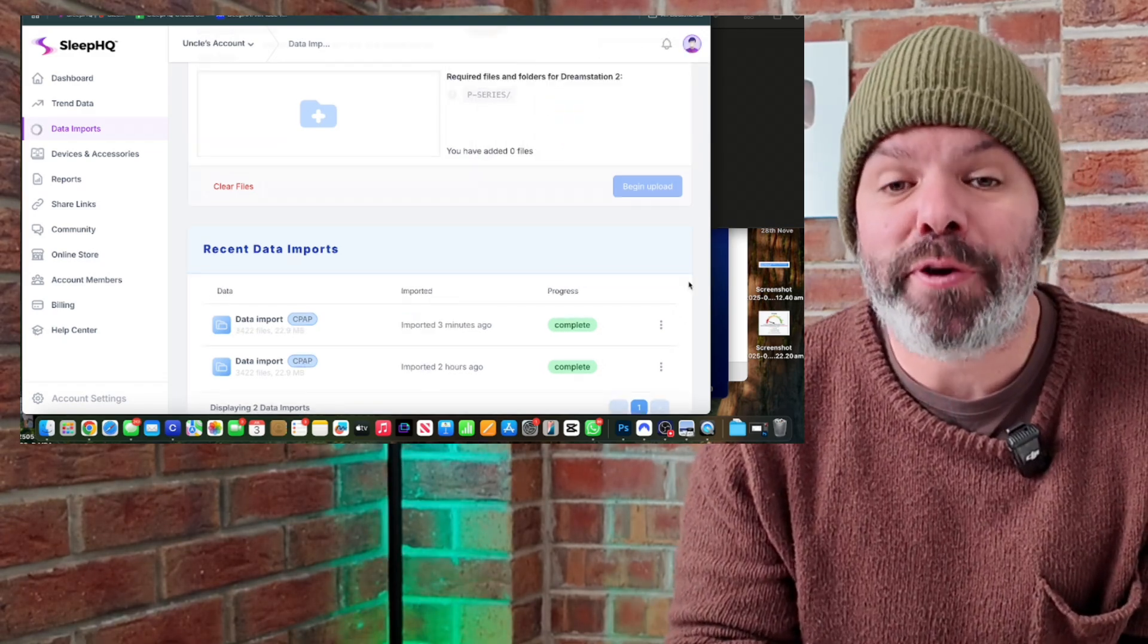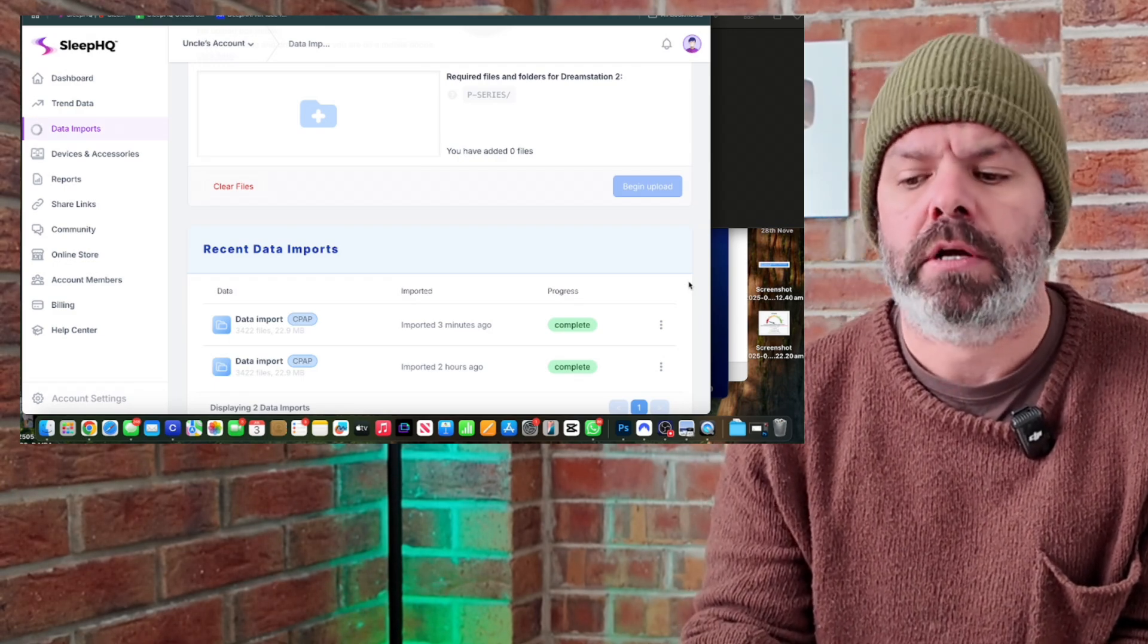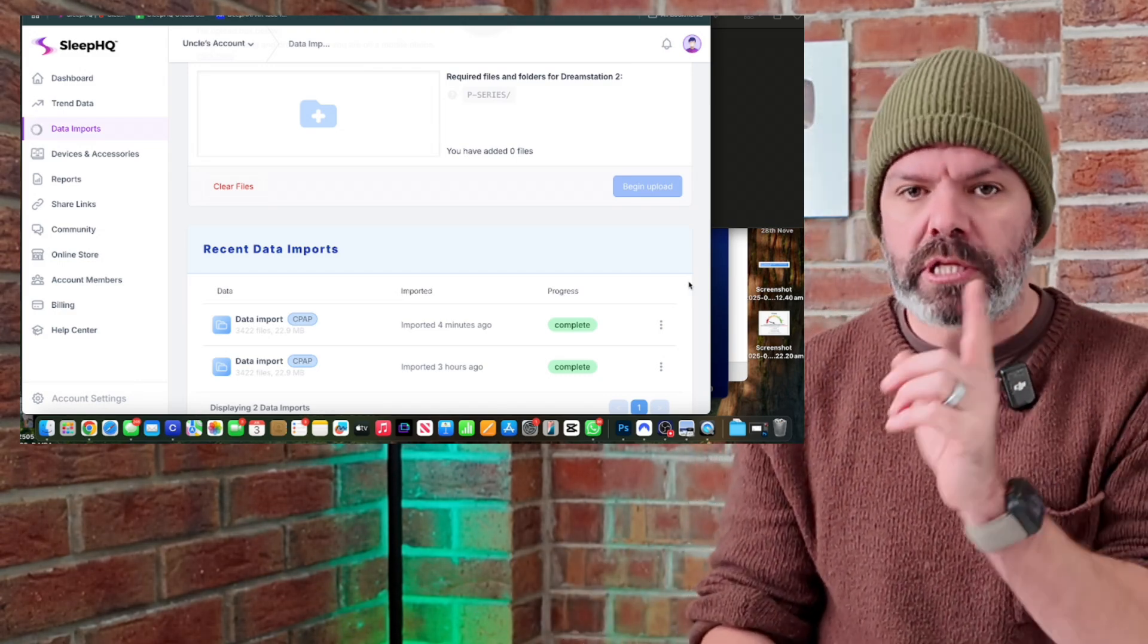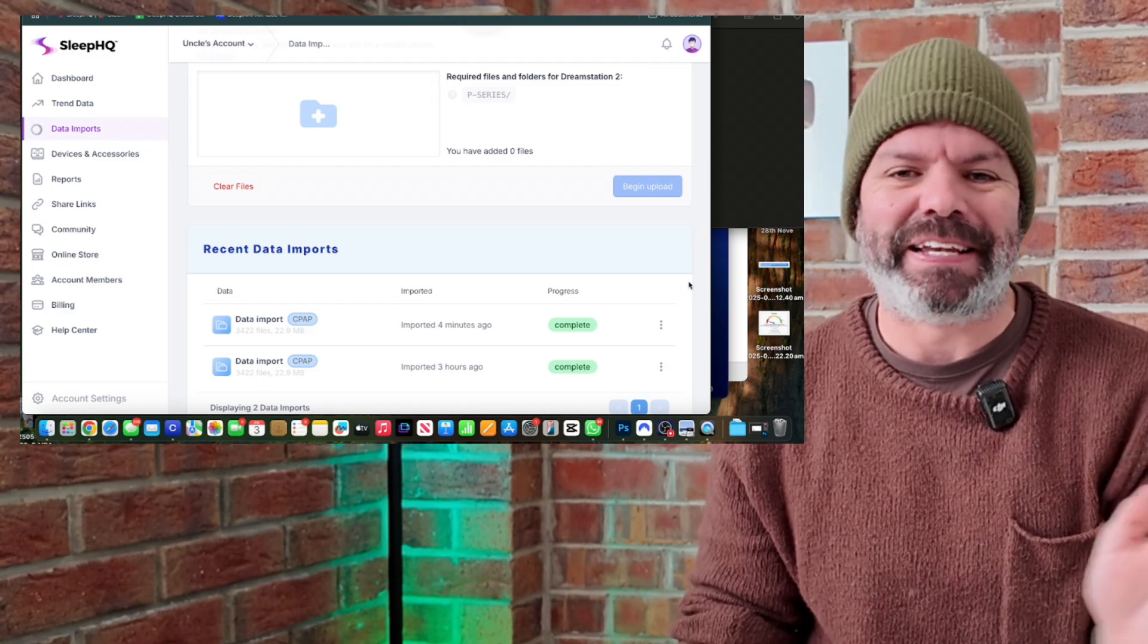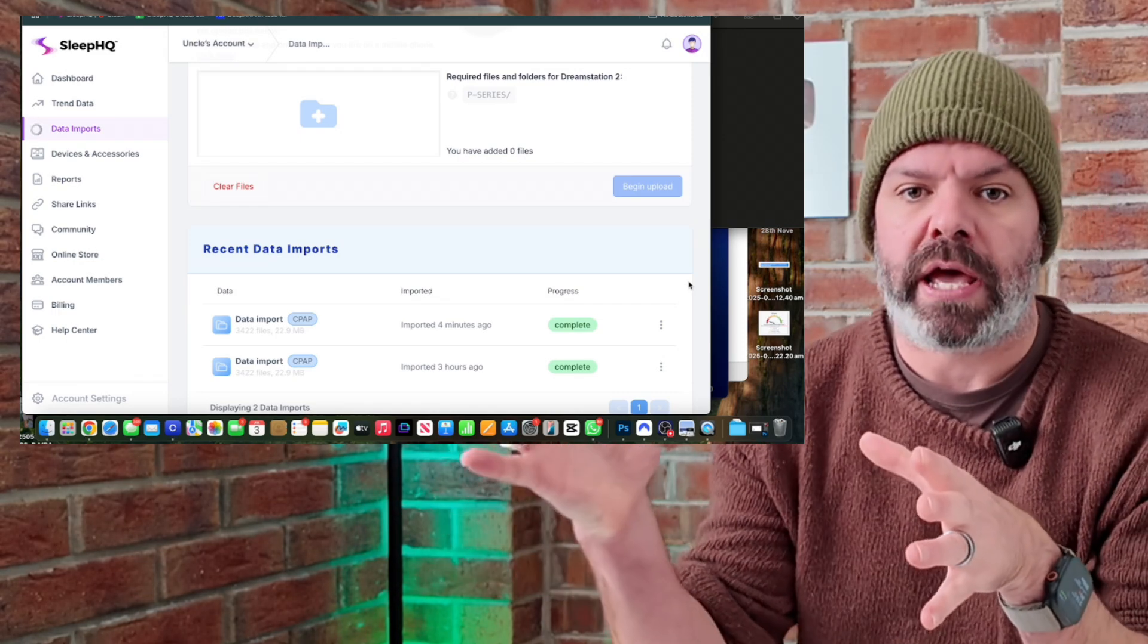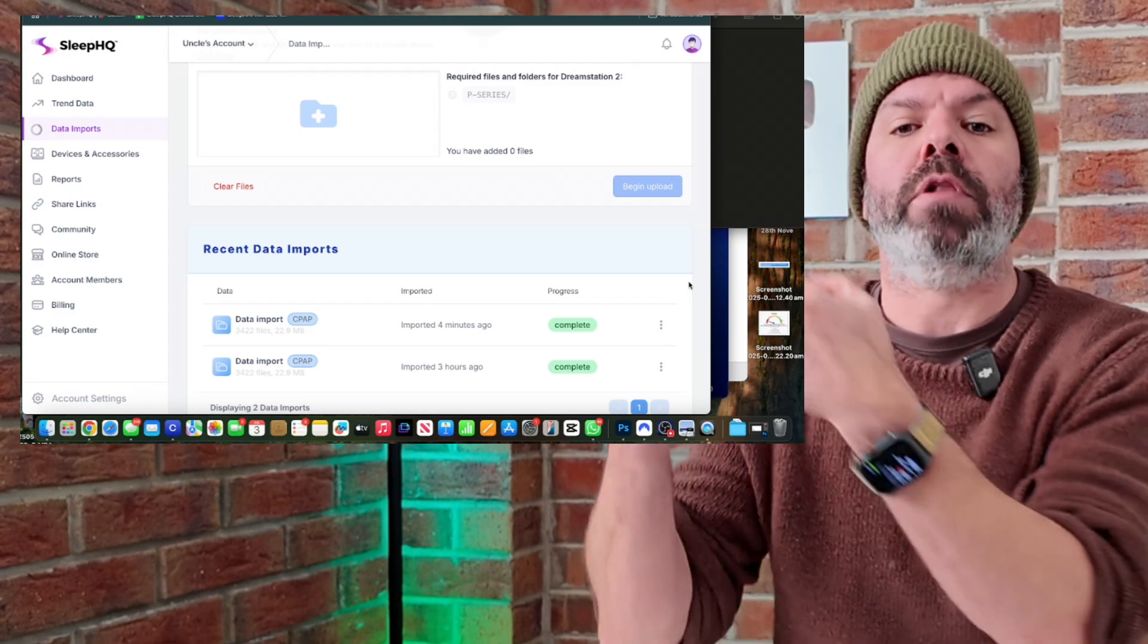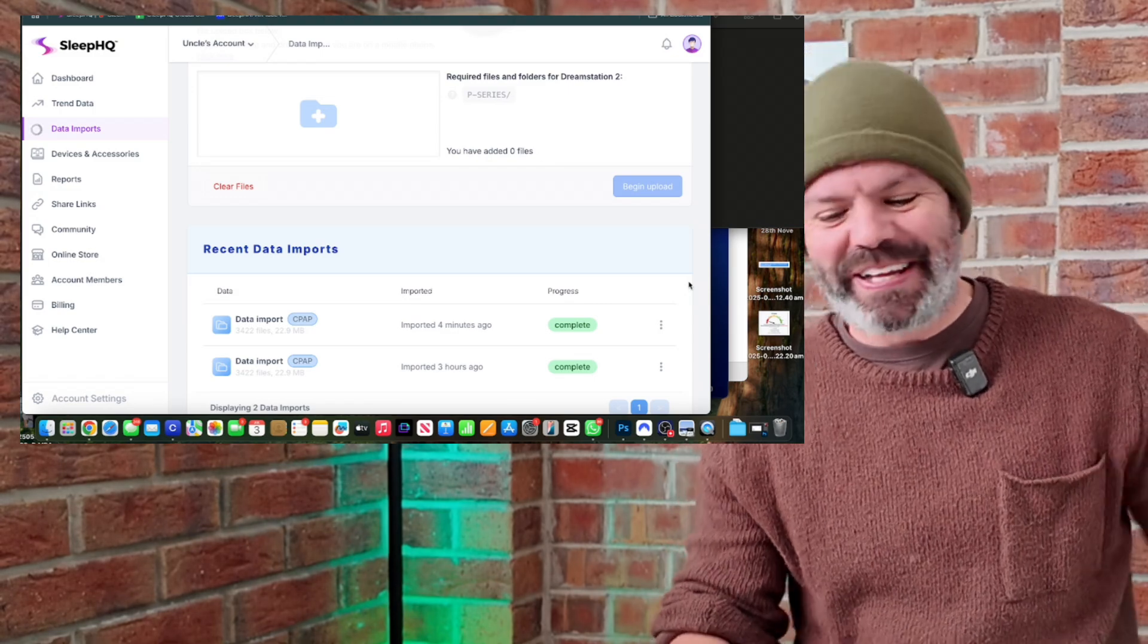Now if it's your first upload to Sleep HQ and you've got a lot of data on the card, it can sometimes take a bit of time for the platform to process all that information, analyze it and chart it for you. So just click begin upload, go and make a cup of tea, do whatever you need to, and then come back 15, 20 minutes later and you'll be good to go. Future uploads will take a lot less time because the system will analyze all the files and will only upload the new information. So it won't upload 2024, 2023 and so on.